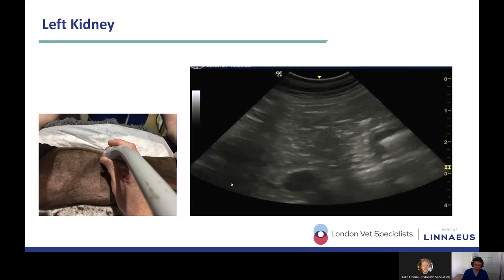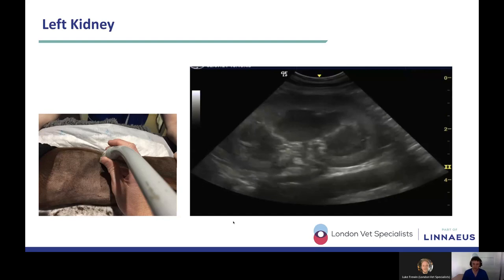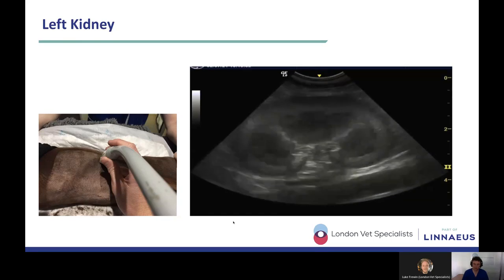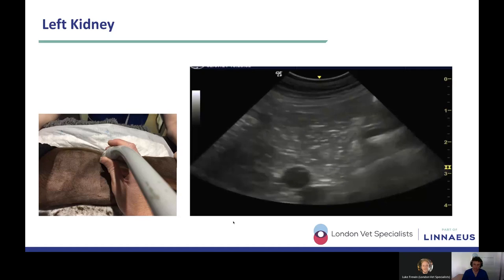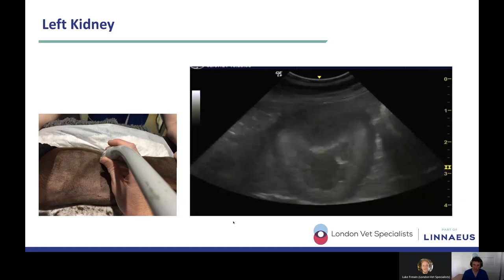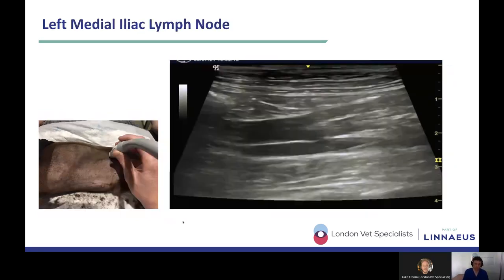If you've got a nice either sagittal or dorsal view of the kidney, which I have, and you've fanned dorsally and ventrally through that kidney, which I have, it looks normal, and you rotated it, and you've slid the probe cranially, and you've slid the probe caudally, and it all looks absolutely fine, then you can be pretty confident that you've done a very comprehensive ultrasound examination of that left kidney. Essentially, it's time to move on.